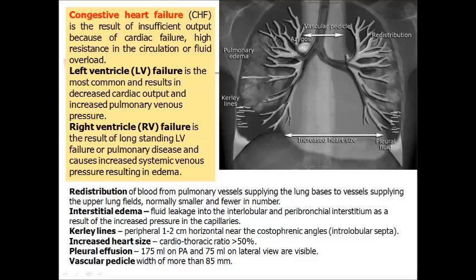Redistribution, what does it mean? It's redistribution of blood from pulmonary vessels supplying the lung bases to the vessels supplying the upper part of the lungs.